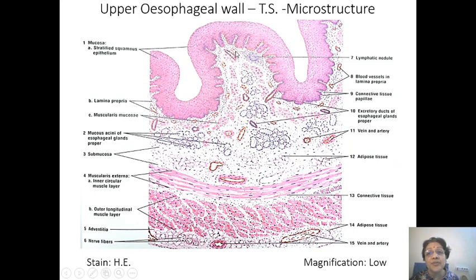And how will you differentiate the two? Blood vessels here will be capillaries, so they will have a simple squamous internal lining. There's no tunica media or externa at all. It's only a tunica intima of simple squamous epithelium, 2 or 3 dashes as nuclei. That's all. There's no thickness. There's no material in the wall.